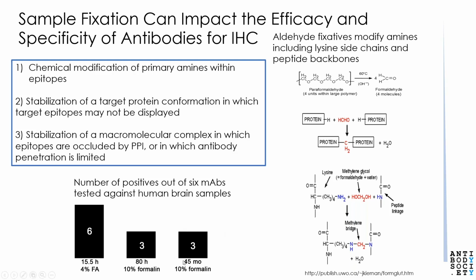The lower left graphs show a summary of data showing that longer fixation times, typical of pathology samples, reduce labeling with a set of monoclonal antibodies initially validated on more lightly fixed tissue, emphasizing the importance of defining and transparently reporting the precise conditions used for antibody validation, including on antibody data sheets from suppliers, as antibodies validated under one fixation condition may not perform under others.